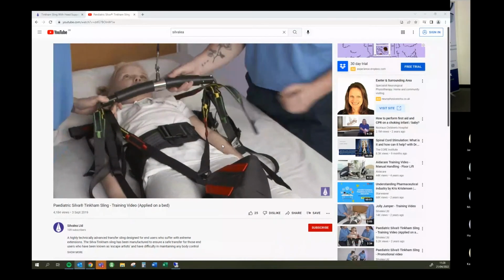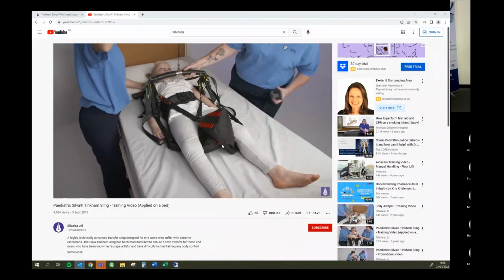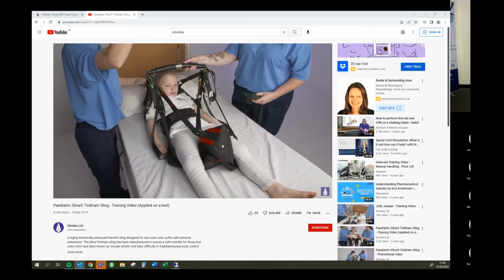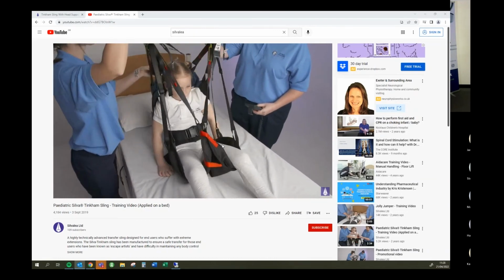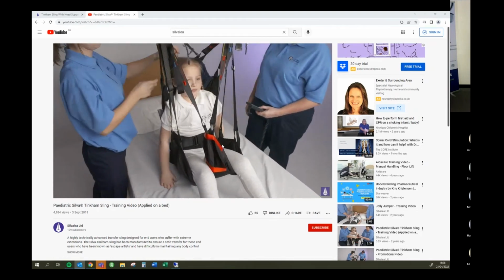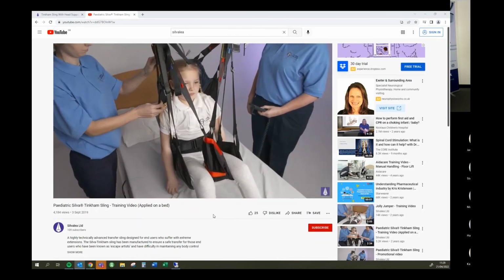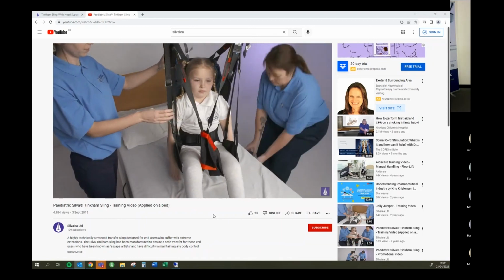We had a scenario in New Zealand where they had to transfer someone in a very specific position, otherwise the airways would be affected. So this really helped by getting them into this specific position and preventing them from throwing their head back. And then gradually, when you take up the slack, check it all. Check you've got all the tapes on, hip tapes are positioned correctly.